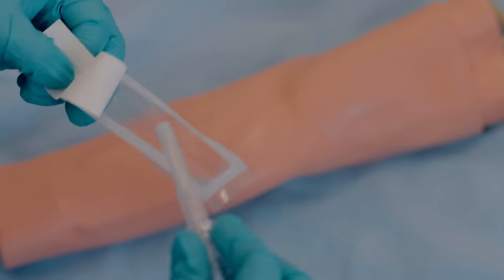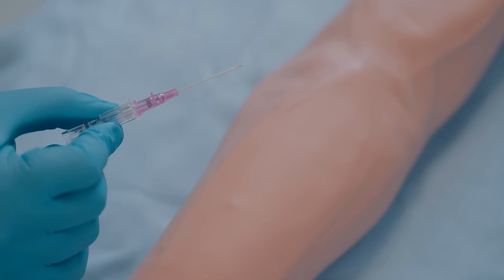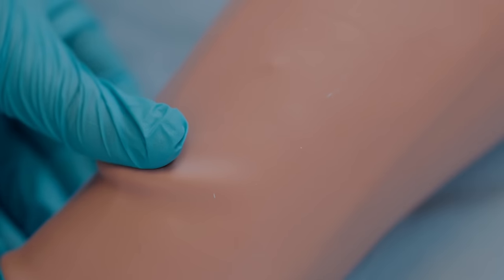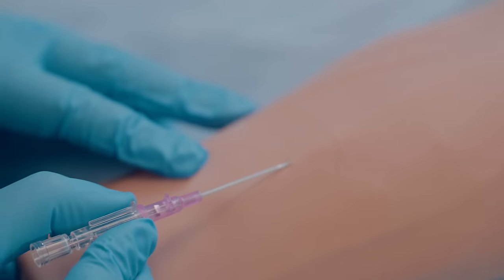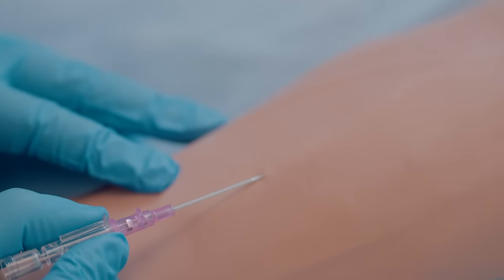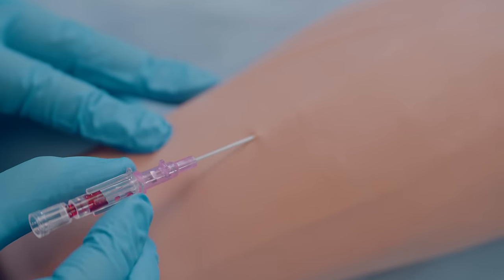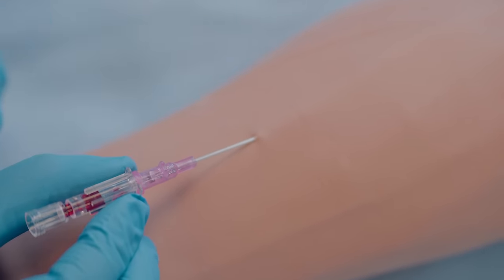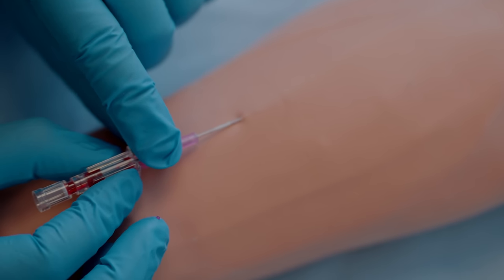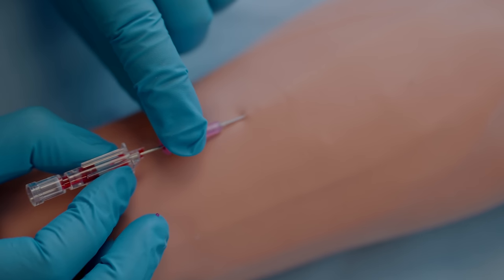Now remove the cannula from its packaging and remove the needle cover, ensuring not to touch the needle. Stretch the skin distally and inform the patient that they should expect a sharp scratch. Insert the needle bevel up at about 30 degrees. Advance the needle until a flashback of blood is seen in the hub at the back of the cannula.